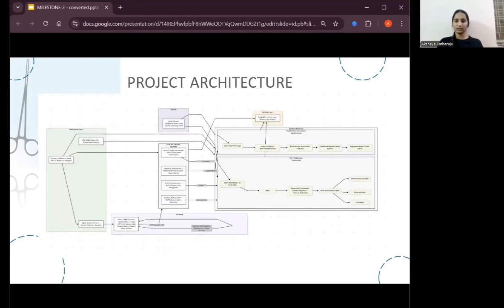The project architecture. Our architecture adapts the TAPIS concept into a real-time web system. The backend connects four AI models that together provide holistic scene understanding. Each handles a specific level: MViT for video-based feature extraction, Mask Former for instrument segmentation, TAPIS Transformer for phase and step recognition, MViT for atomic action detection. The combined output gives a complete view of the surgical process.